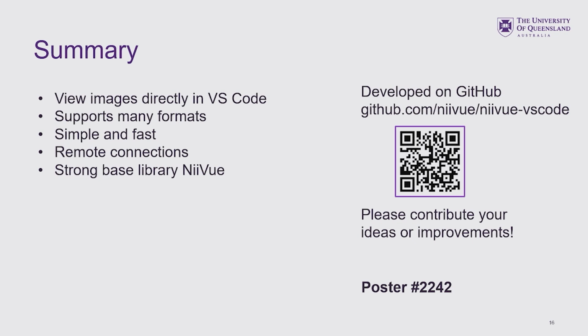So that would be a question to the base library developers, but I think the support is very good. So for all images I used, it nicely registers them. And there's also a large number of test images, all with different orientation information, and all are rendered correctly. So I guess they took really a lot of care to make this perfect. Thank you.